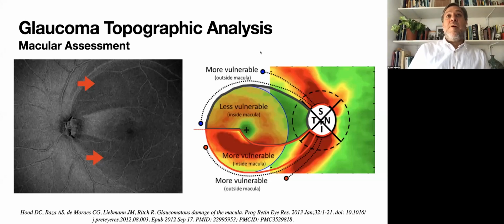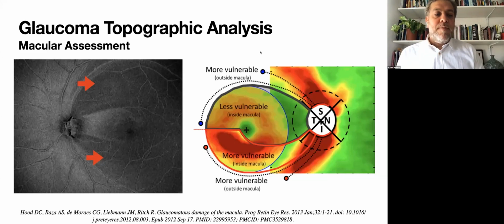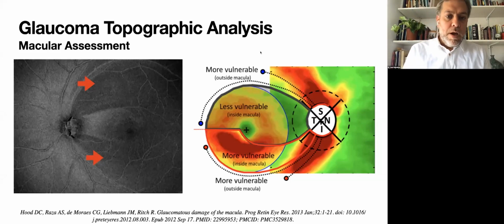And sometimes, if you are an experienced reader, you could look at the defects on the reports or on the exams. It's always good to have a review station where you could go through all the B scans. If that's not possible, you could spot some of the defects on the scans, but it's more advisable to have the doctors or the people taking exams be really good at spotting this type of abnormality.